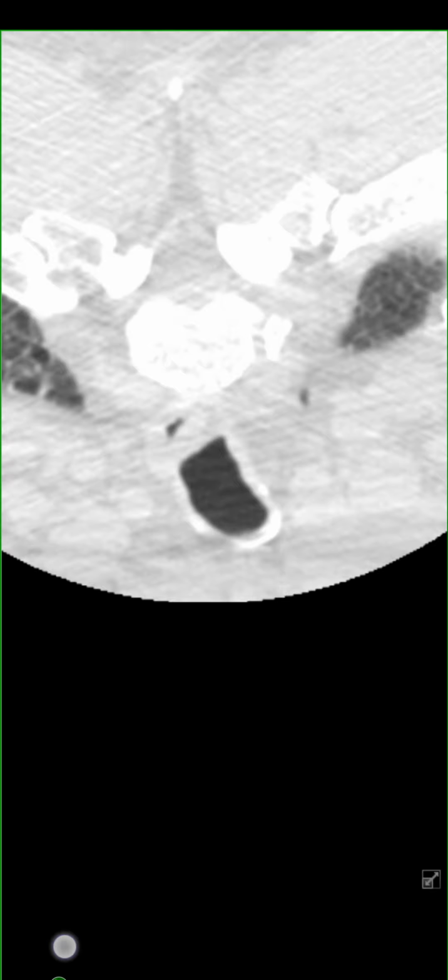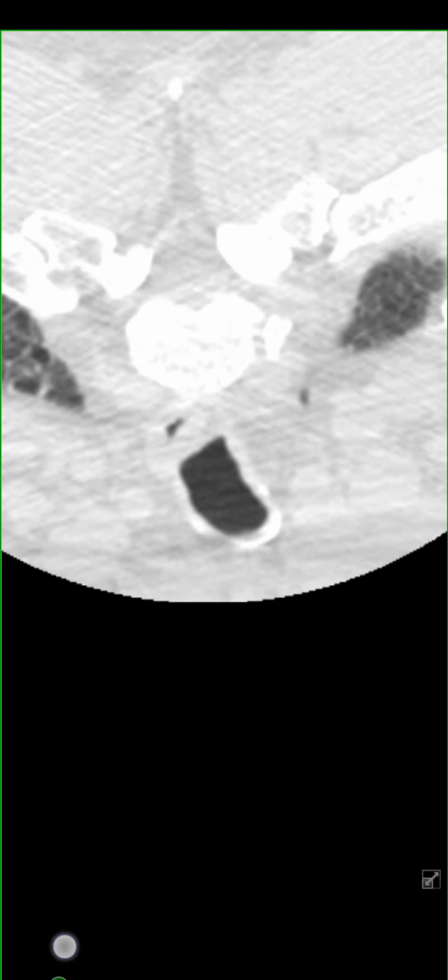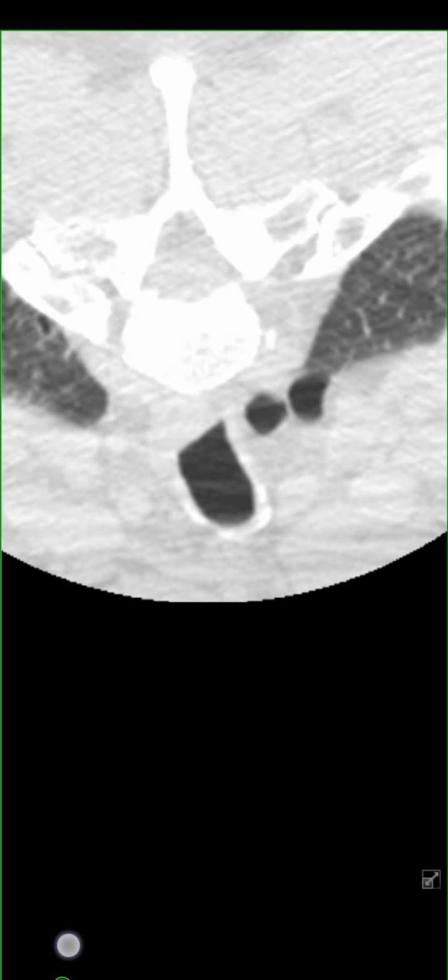Coming into frame on the right hand side of the screen is my right lung because this is upside down, and you can see the difference between lung tissue and the black emphysemic areas, we'll call them. Now, although the esophagus is still there, you can see the air in it. It's gotten a little smaller, but you can see the pulmonary bleb or persistent air leak or hole in my lung coming into place between the trachea and my right lung. That hole bursts out of my lung outside of the pleural area and creates a second bubble of air.